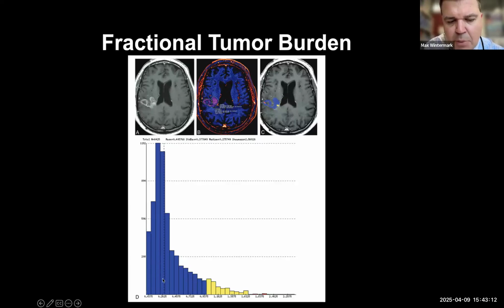And you can see that in this particular situation, the majority of the enhancing area actually has low cerebral blood volume. There are a couple of voxels here in the deep component where the cerebral blood volume is a little bit more increased. There's also a very tiny area peripherally where the CBV is significantly increased. So it suggests that the majority of these lesions consist of treatment changes, but there may be a couple of components where the glioblastoma is still present and may grow in the future.